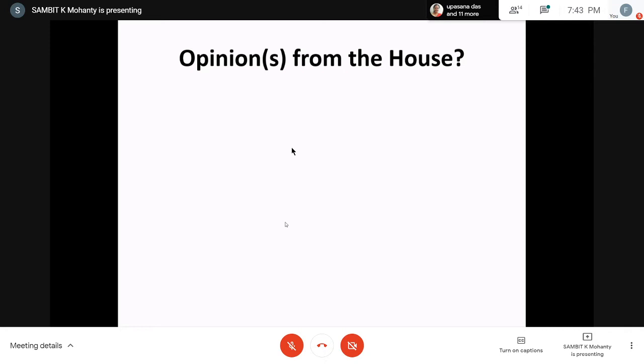Do you want to do any stains to know the nature of that follicle? Pulkit, do you want to do any stains to chase after that follicle? Yeah, at least CD20, BCL2 and CD30. Okay, those would be done.